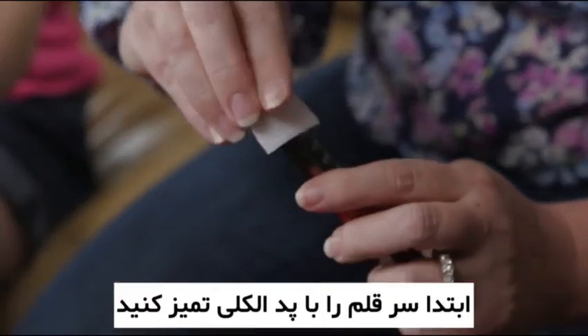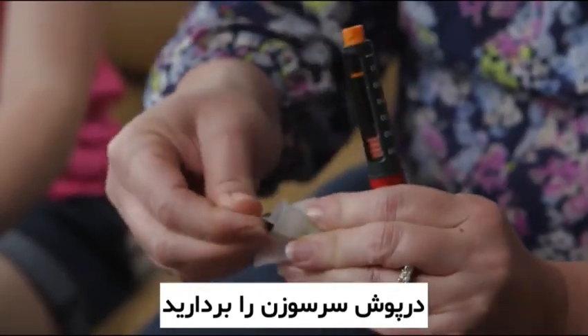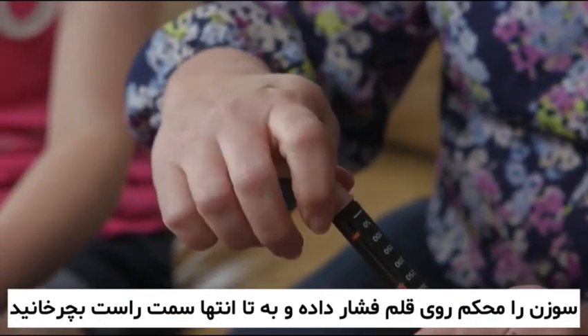First, clean the rubber stopper on the end of the insulin pen with an alcohol pad. Next, remove the protective tab from back of the pen needle. Press the needle onto the end of the pen and twist to the right until it is tight.